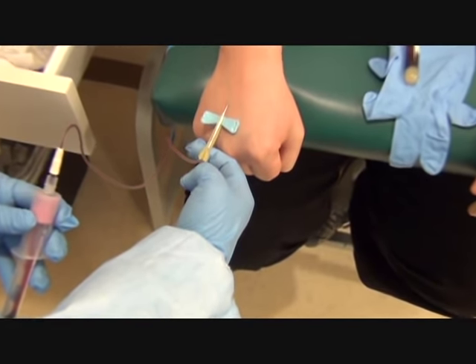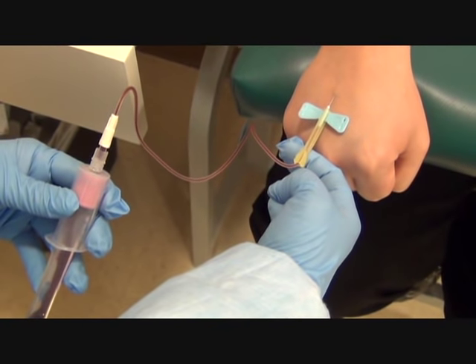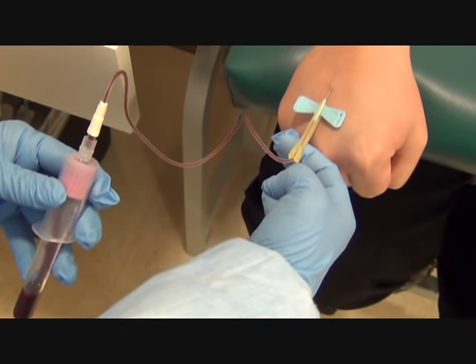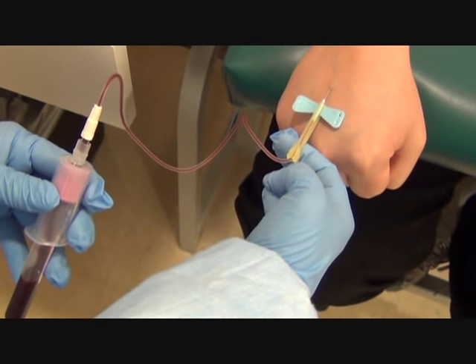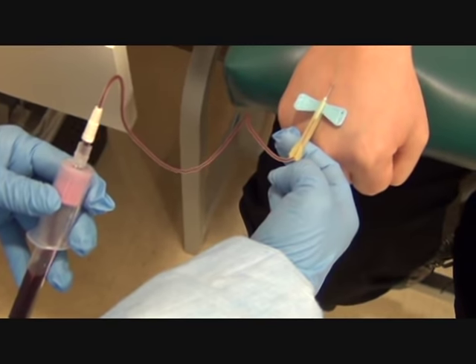Because I lost my flow, I have to either lift up my angle — which I don't want to do. I got a better flow because the vein went back to normal size once I popped the tourniquet. Or another way I could have done it is I could have anchored on the skin a little more, and it would have come back to the surface so I could have got the flow better.